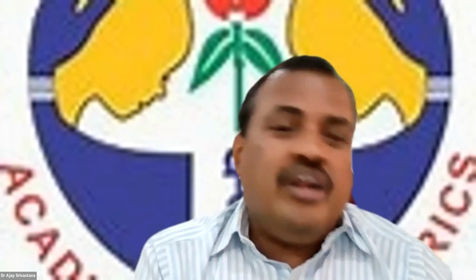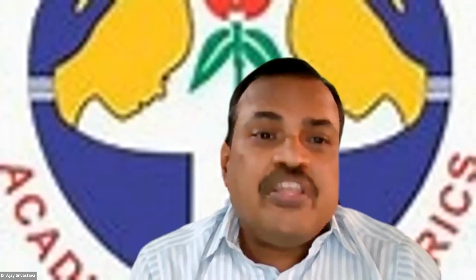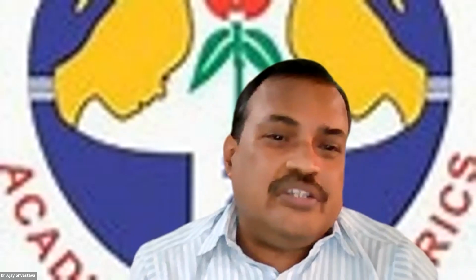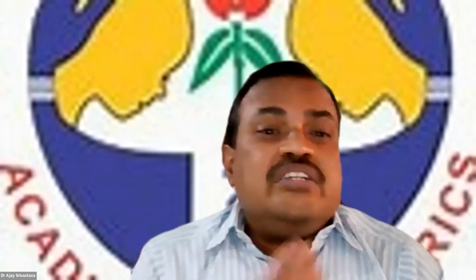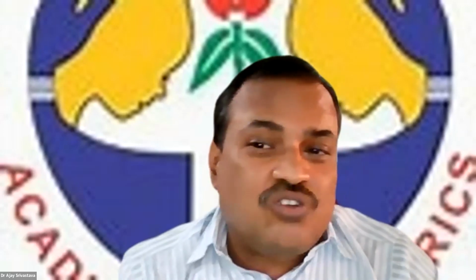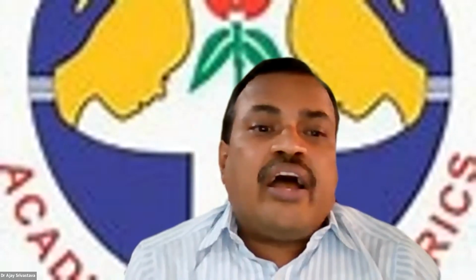So finally, remember, an abnormal EEG does not necessarily mean epilepsy. 10% of people without seizures can have non-specific EEG abnormality. Decision to start AED is based on recurrence risk of seizure and not only abnormal EEG. Someone has asked a question, so the answer is this.